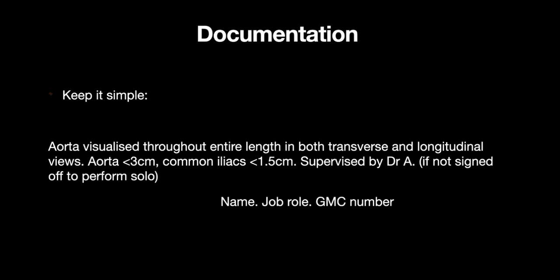If there have been parts of the aorta that you've not been able to visualize, then of course write it here. You'll commonly see written "aorta not visualized well due to bowel gas," or "not seen proximally due to bowel gas." So you can put that here in the documentation section, and it may be in your clinical notes later that you justify the reason for doing a further scan, or maybe for not doing a further scan. But just keep the report factual and leave any opinion as to what kind of clinical management you're going to do based on your scan, leave that to another place.